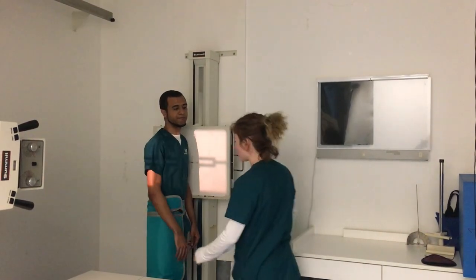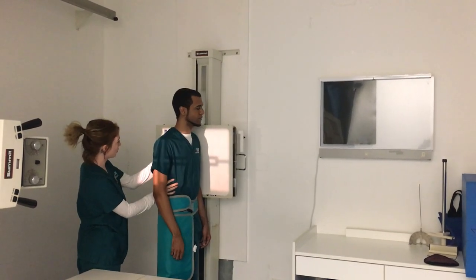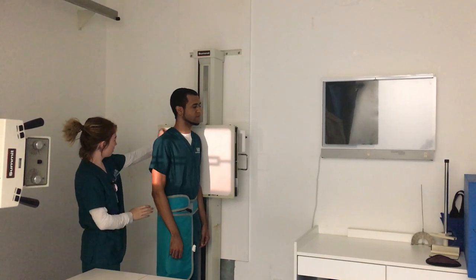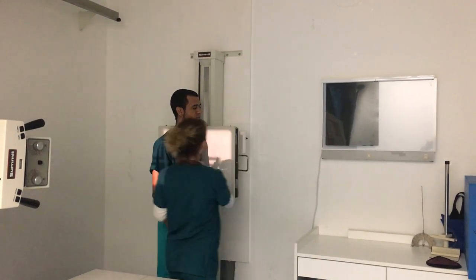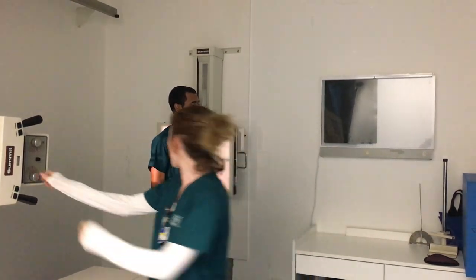And then make sure the patient is in the center with no rotation. You can feel that on his back. We'll move my left marker to the front and collimate it down.